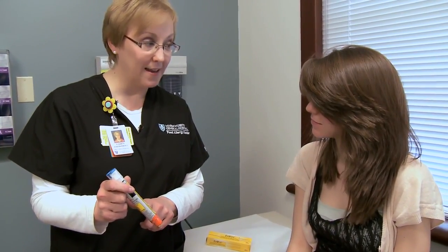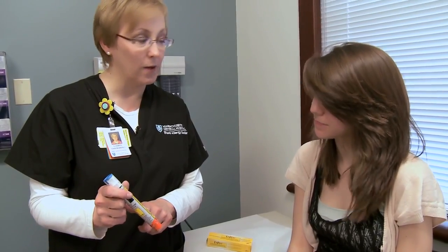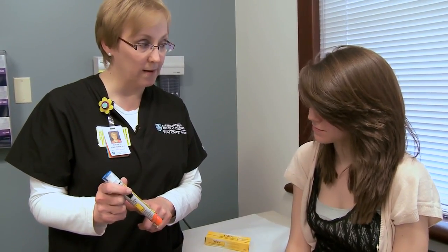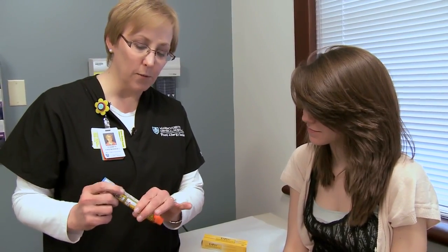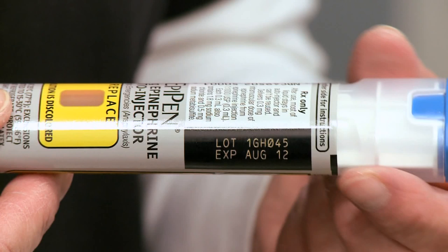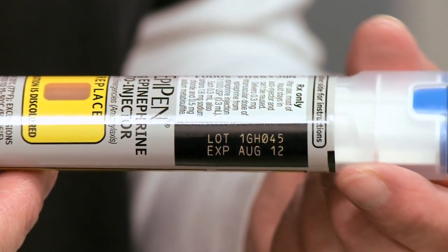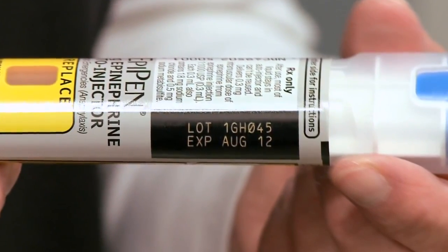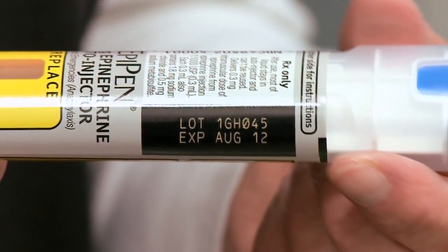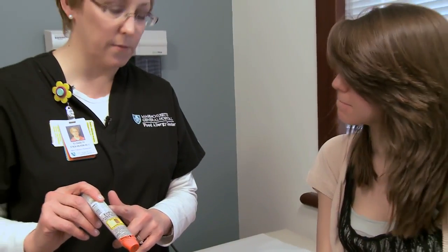If it's all you had and you had no other option, I would still use it — and call 9-1-1. Give the epi first and then call 9-1-1. Also on the real one are the lot number and expiration date. Keep it within the expiration date. When you pick them up from the pharmacy, it should last you a year, so if they're giving you one with only six months' expiration, ask for another one. Know where the lot number is in case of any recall.